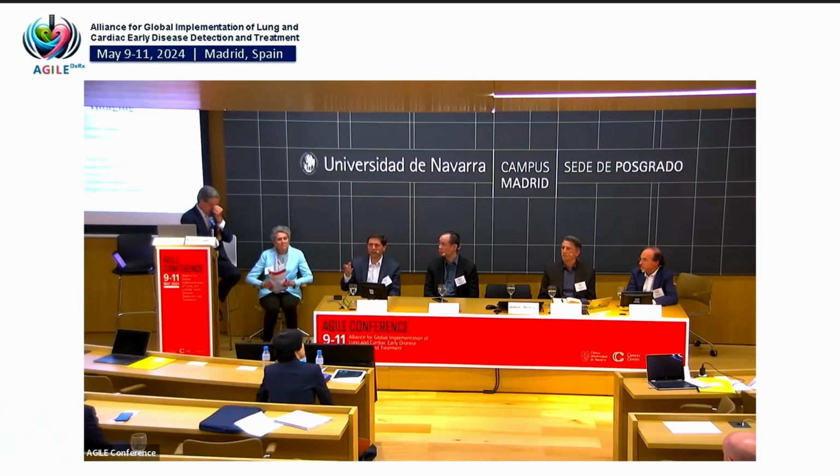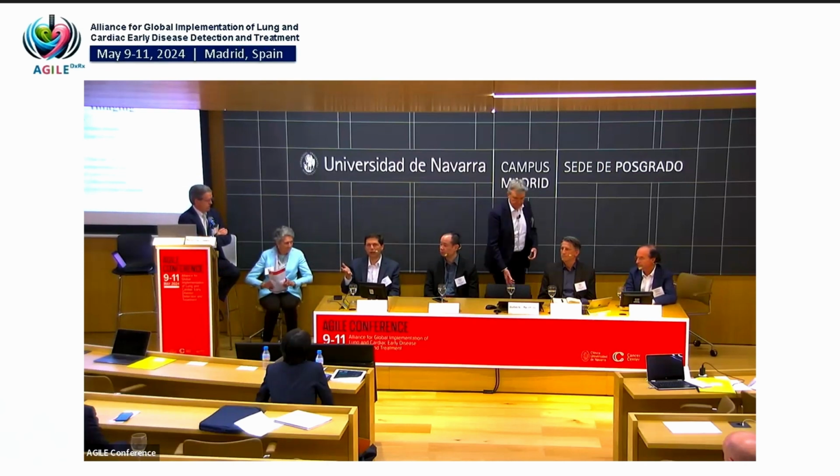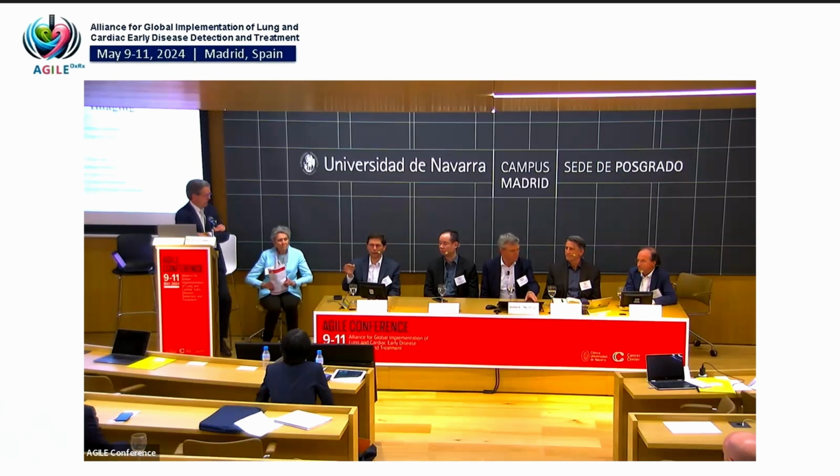The problem is that to see the features of that object is extremely difficult with current CT scanning technology. You'll often lose the spiculations. You'll lose a lot of the size of the nodule itself. It's extremely hard to make these objects, the spiculated one in particular, but they're very useful for assessing both the bias and precision of CT scanning, imaging, and software algorithms combined.